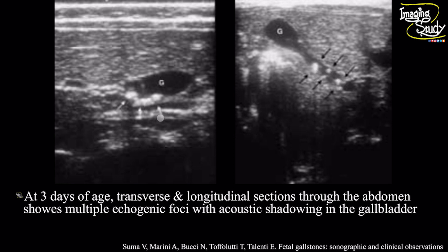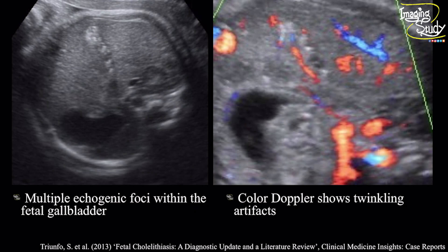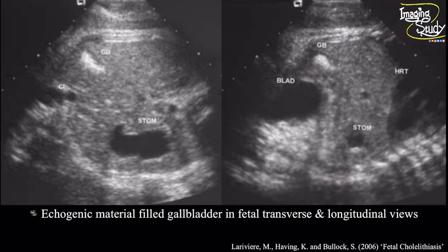Most of these stones will get resolved within two to three months, so make sure to give a follow-up. Here again, another case showing the hyper-echogenic foci within the fetal gallbladder lumen, and on color Doppler you can see some twinkling artifact from these hyper-echogenic structures indicating cholelithiasis. Another case shows the hyper-echogenic material-filled gallbladder in transverse and longitudinal section of the fetal abdomen indicating cholelithiasis.